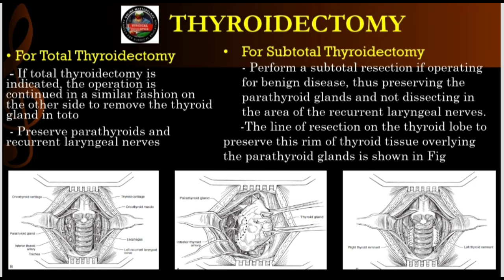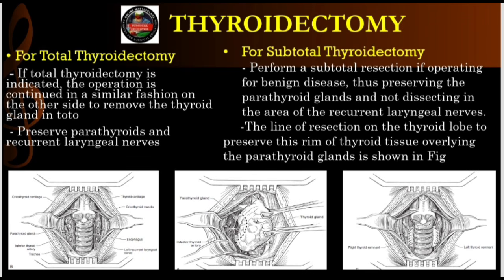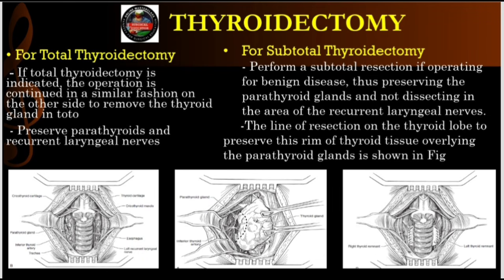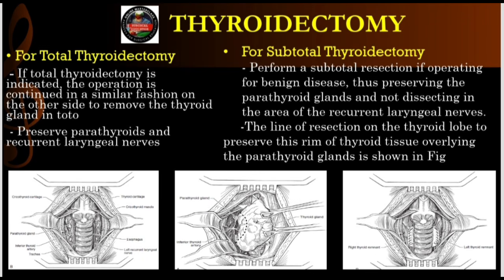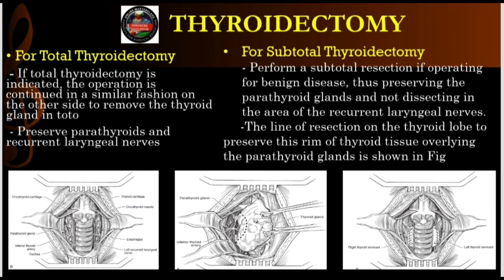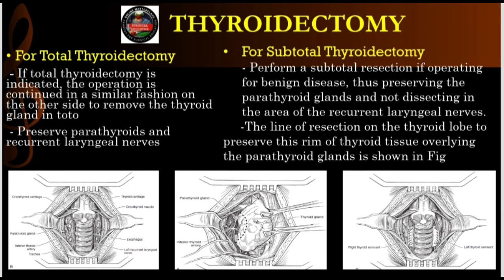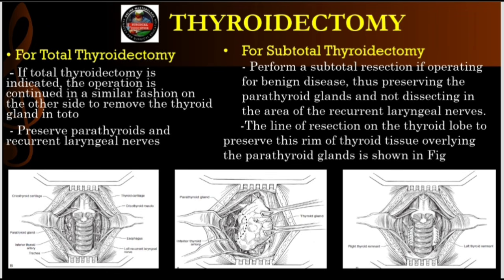Right, because if you do a hemithyroidectomy and accidentally cut the right RLN, the right vocal cord paralyzes. Which is terrible. They're hoarse, they choke a bit, but the left cord still works, so they can breathe. But if you're doing it total and you damage both RLNs, bilateral vocal cord paralysis. The cords don't just fall open, they paralyze in the paramedian position. They fall dead center and slam shut against each other, completely sealing the airway. The second the anesthesiologist pulls the breathing tube out, the patient begins to asphyxiate. It's a catastrophic emergency. They usually need an emergency surgical hole in their neck, a tracheostomy, just to survive.